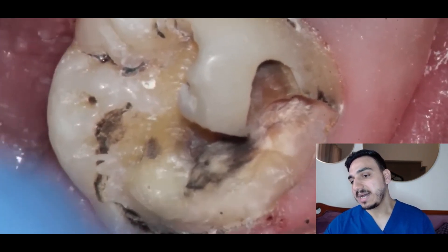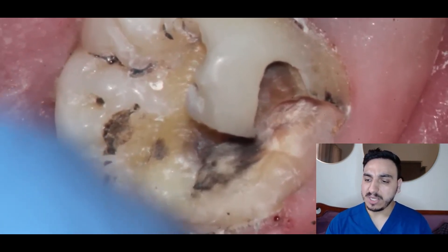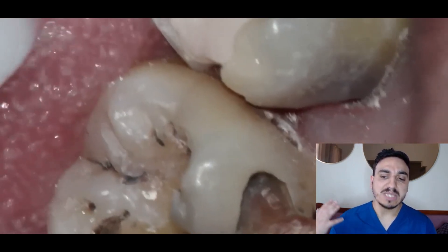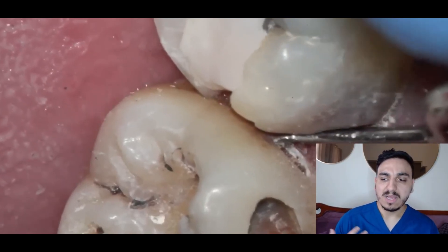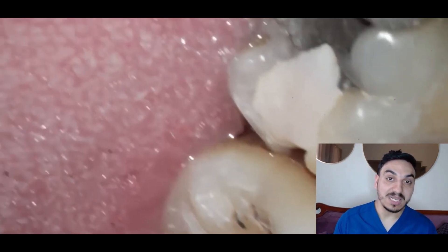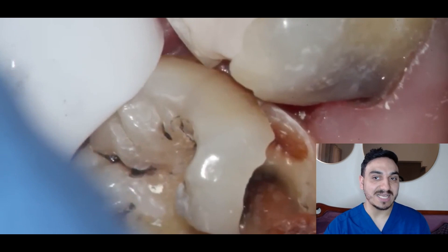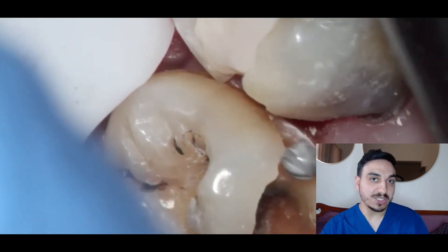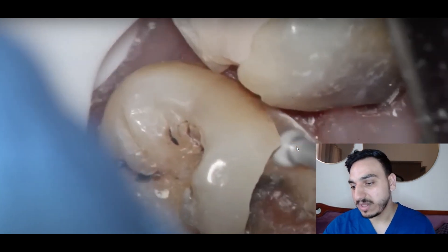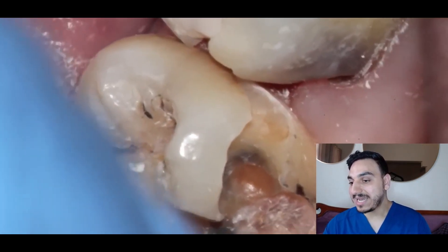The cavity is on the occlusal surface — the surface we chew on — extending into the buccal surface. It looks like a molar; very extensive cavity, to be fully honest. In this case the dentist may reassess the situation. We've also discovered another cavity proximally. Prior to a procedure like this, the operator may take a dental x-ray to assess and examine the tooth condition, since decay can occur proximally — meaning on the sides between the teeth.